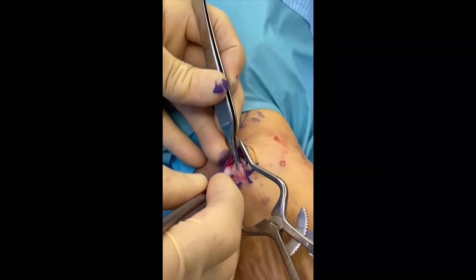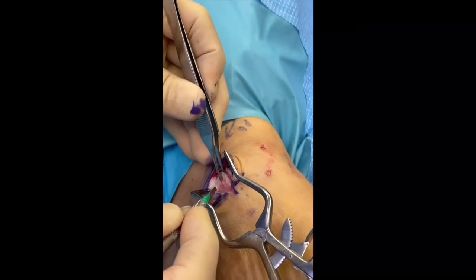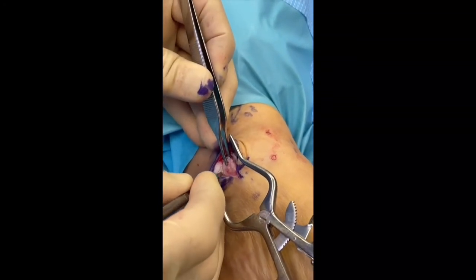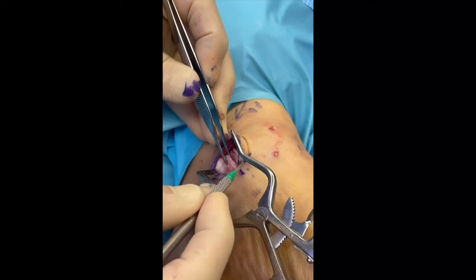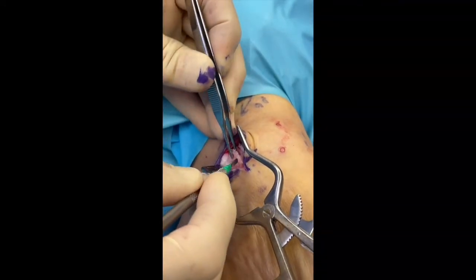So we're at the level of the ankle and I am grabbing the osteochondroma right now. The nerves are on either side of this, so we're in a safe area and the nerves are protected.